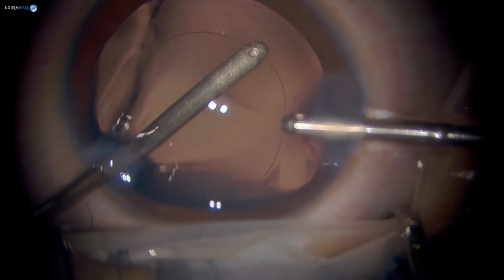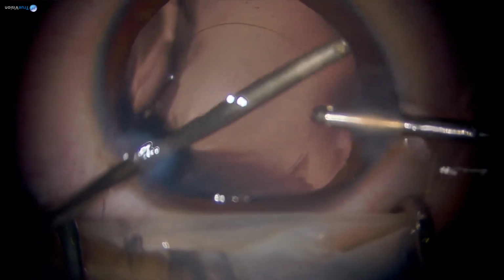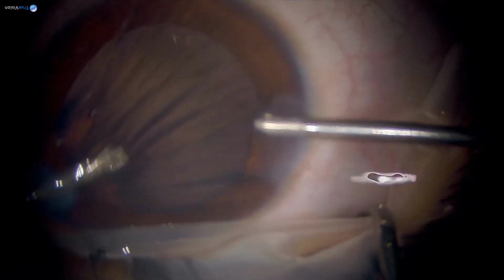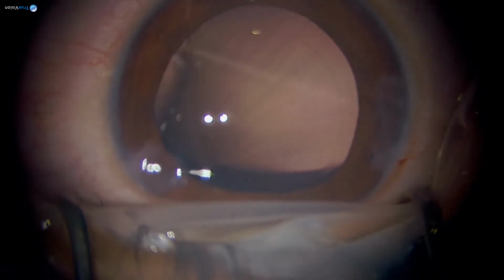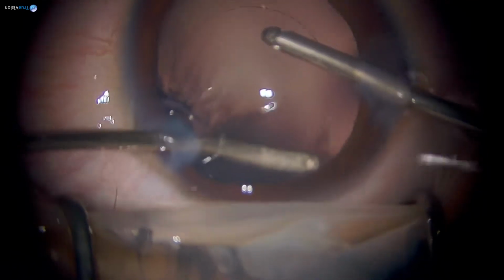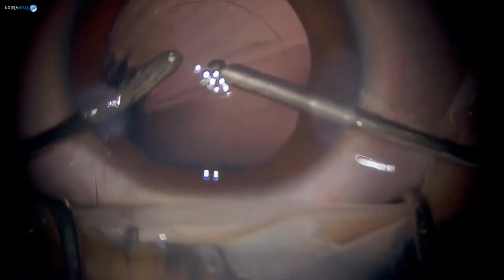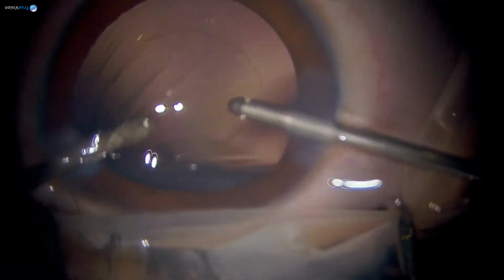I'm trying to remove, see in this area, these are the cells. It takes more time, but I think it's worth removing all of these cells as much as possible. Just a few cells are left. I'm a little bit persistent about that, so I do it in every case. I think it helps. We'll implant the lens now.